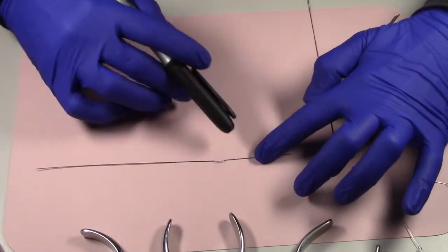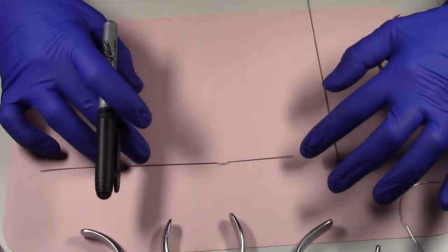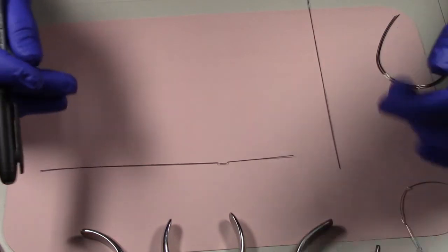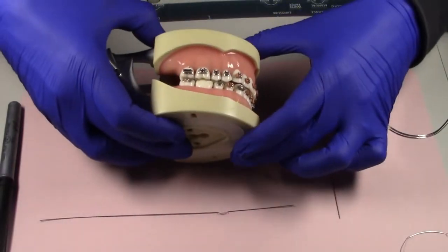Also, it doesn't need to be a really large bend. Think about the size of the bracket and the area in which you're going to affect. So why do we put bends in wires? We want to think about moving a tooth in a certain direction.